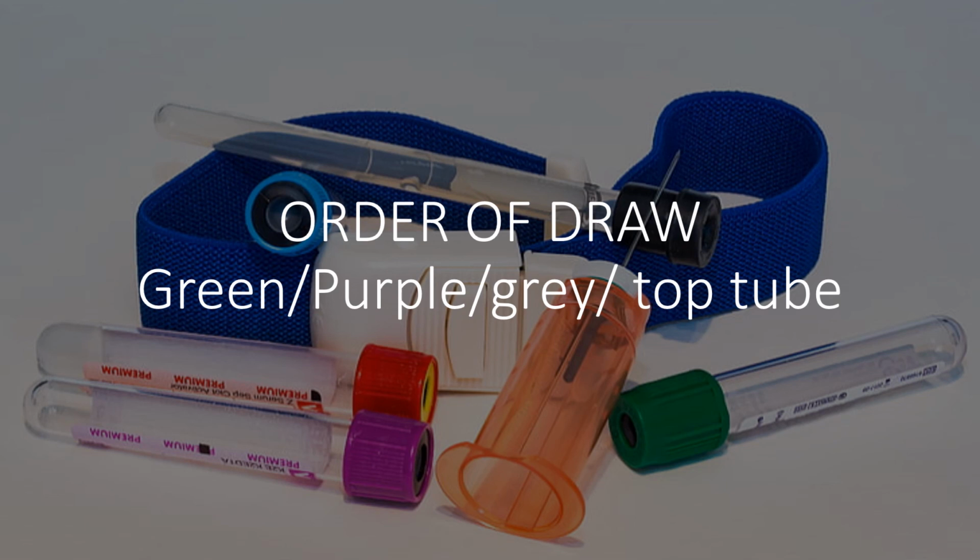So those cells are in there, they still want to stay alive, right? So they use that glucose as energy, and that sodium fluoride stops that glycolysis. It also prevents bacteria growth, same way, because the bacteria doesn't have anything to grow off on, so that won't grow. And then it has potassium oxalate. So it has two additives, right? We talked about the sodium fluoride. It also has potassium oxalate, which is an anticoagulant, and it prevents clotting by binding the calcium, which a lot of them bind the calcium, but that's the way that one works to prevent it from clotting. So you can spin it down and do your testing immediately, right?